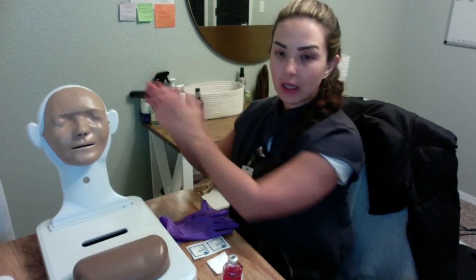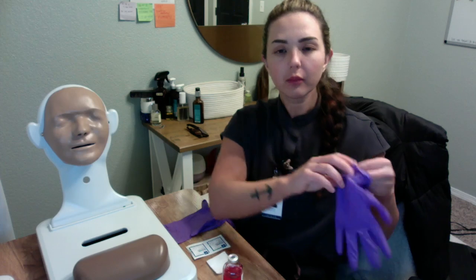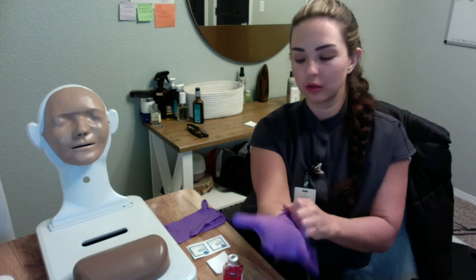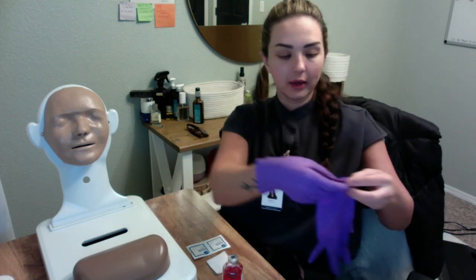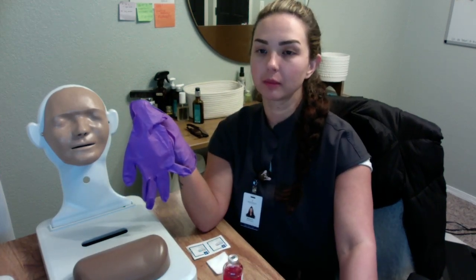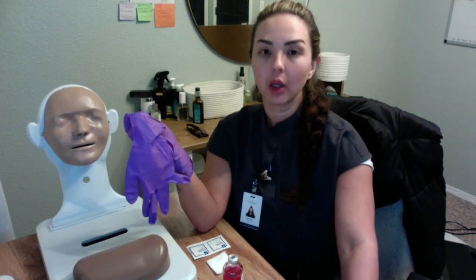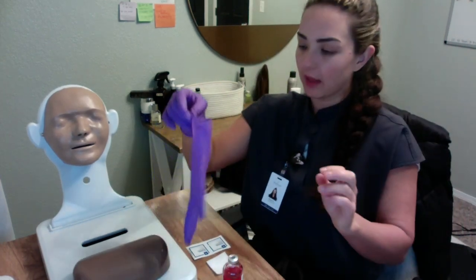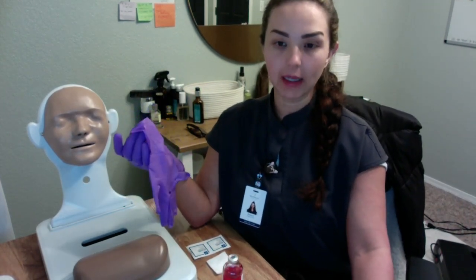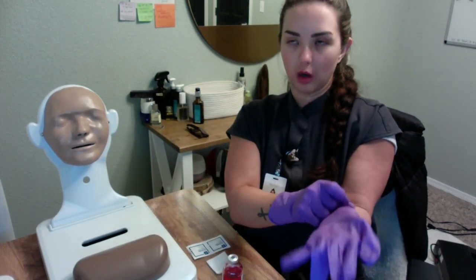So from here, we would then perform our hand hygiene, and then we will go ahead and put our gloves on. We are now going to draw up the medication, and then we are going to administer it. So we'll draw it up, verify it again.